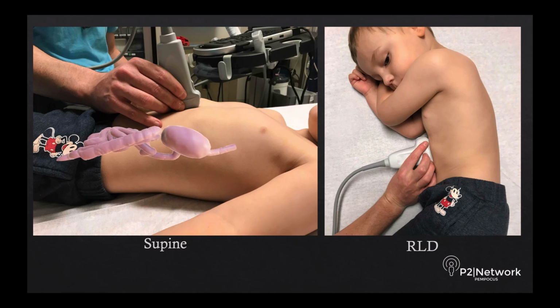In the supine position, when you look at the way gastric content will lay out, here we have our stomach overlaid onto our patient. If there's air in the stomach, that air is going to rise to the least dependent part of the stomach. And with that, your gastric content is going to be below air, which can shroud it, as well as distributed out over the width of the stomach, which can make that content look a little bit less.